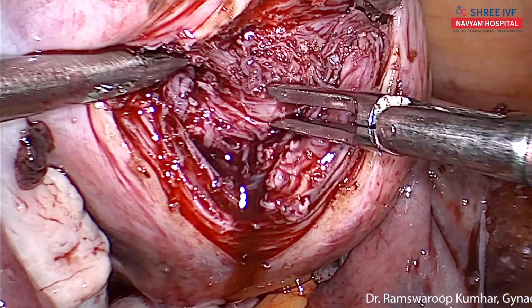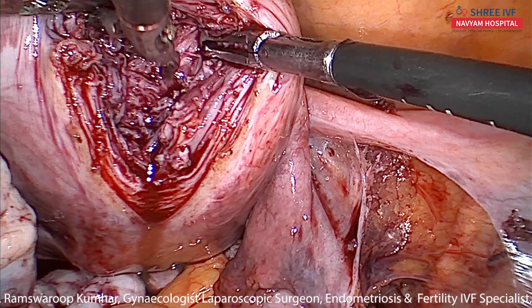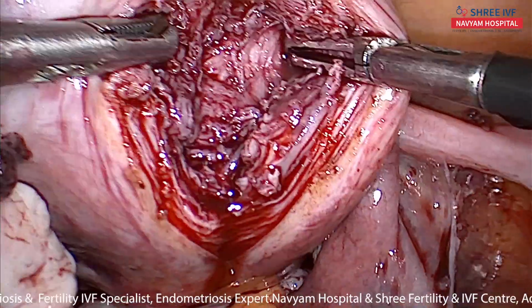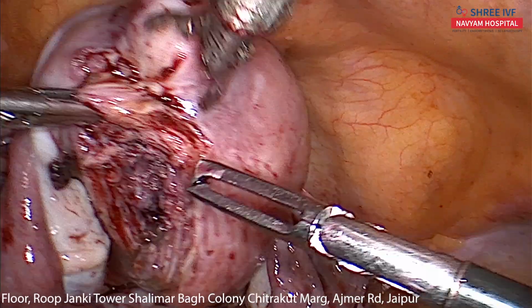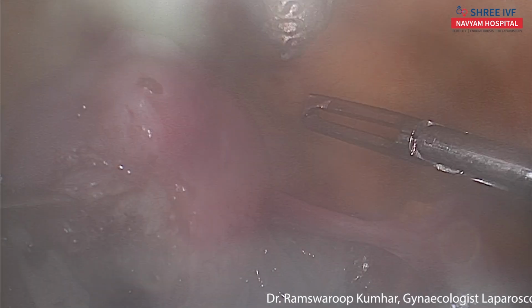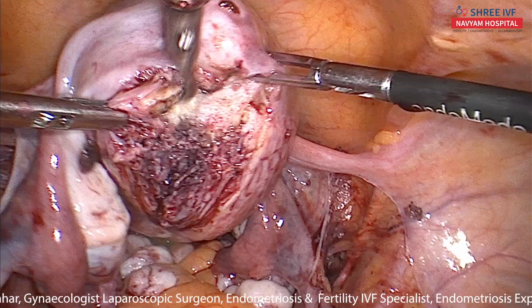Which side? Okay, leave it once. This is the cavity, not a fibroid. Okay, this is the cavity. Okay, leave it. I'm sure this is a cavity, not a fibroid. Now increase the incision. Now you can see the benefit of doing bilateral uterine artery ligation. No more blood loss.